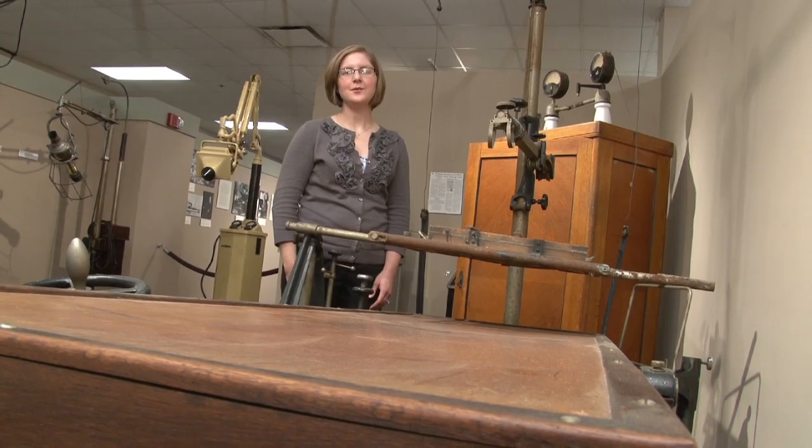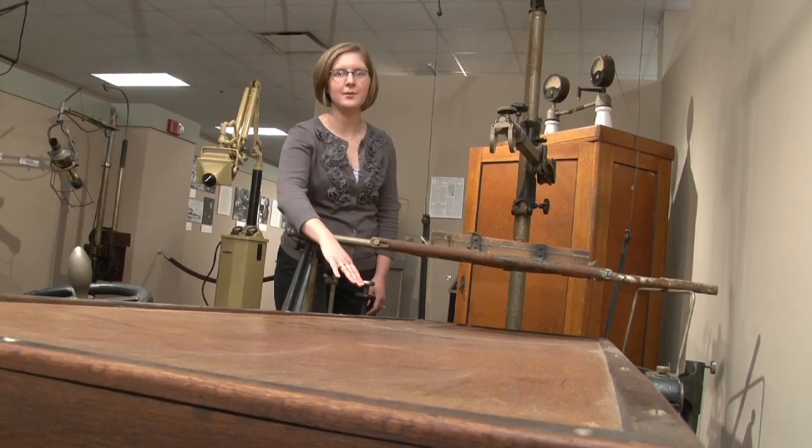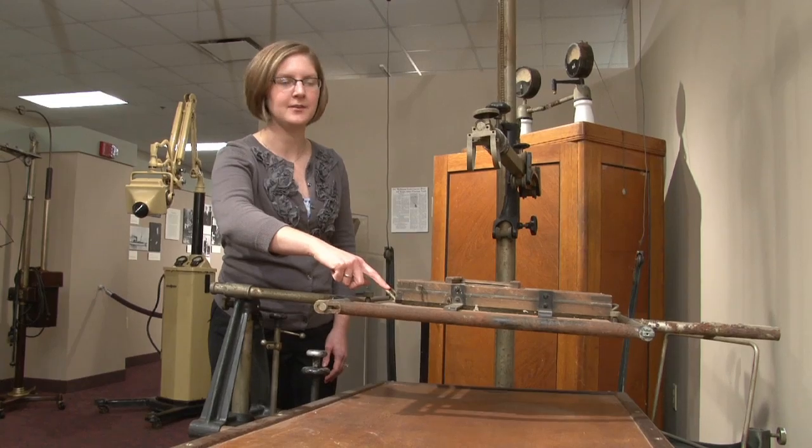This machine could be used to create x-ray images or for fluoroscopy. For an x-ray, the patient would lay on this wooden table.